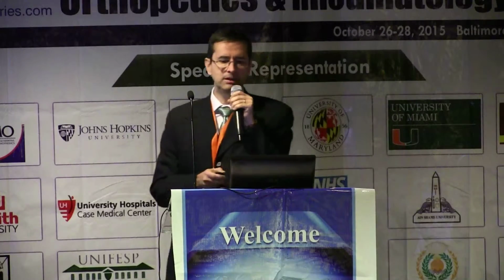Besides assisting in the diagnosis of carpal tunnel syndrome, ultrasonography has also been used in cases of a failure in surgical treatment. In these cases, fibrosis at the surgical site may determine adhesion or even new compression on the median nerve.